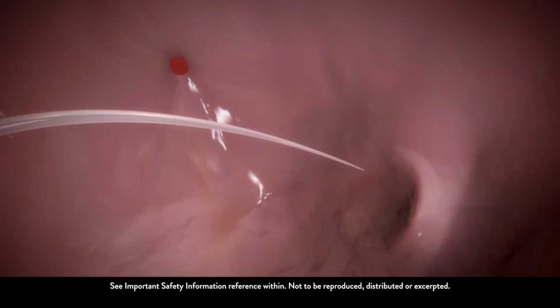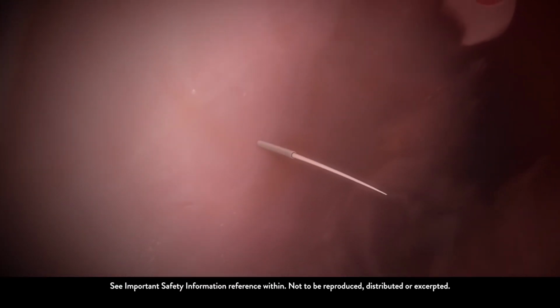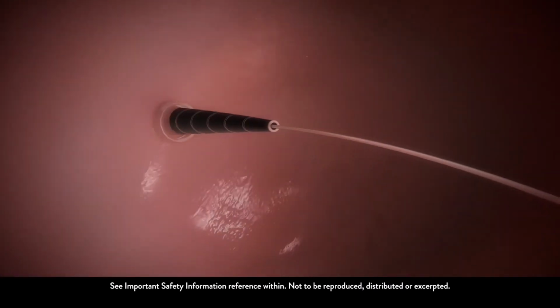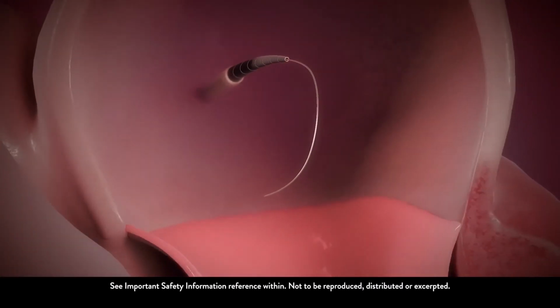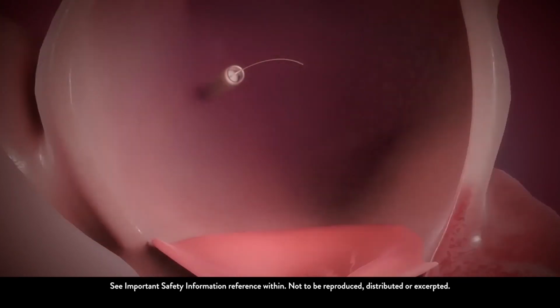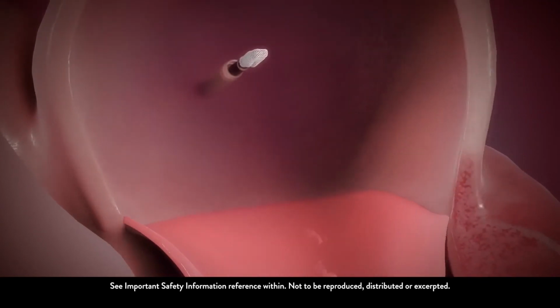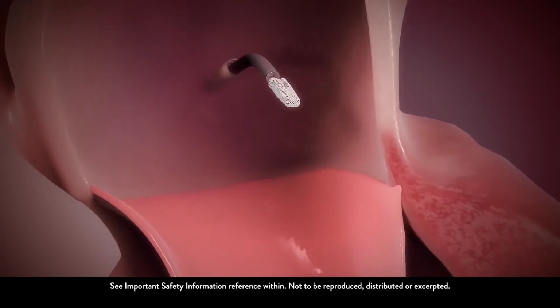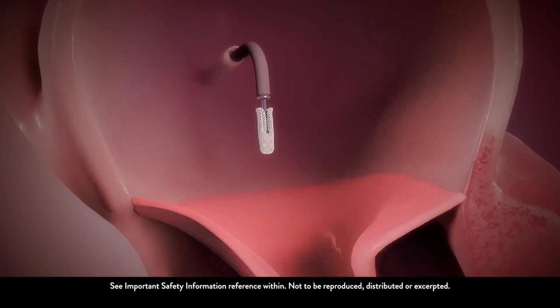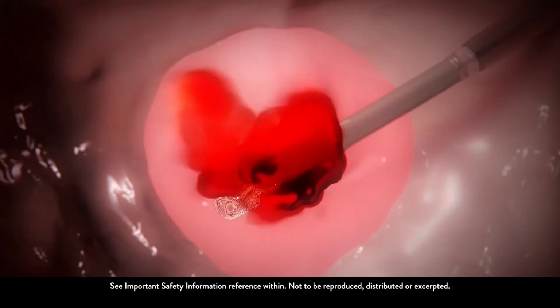In the right atrium, we go through one of the walls of the heart. We go through the septum, which connects the right atrium to the left atrium. Our catheters and wires are inserted into the left atrium. This is our dilator and our steerable guide catheter that is going into the left atrium on top of the mitral valve. Our clip delivery system is then inserted. We have 4 different clip sizes to tailor our approach for the mitral valve. We're able to manipulate down the left atrium on top of the mitral valve.